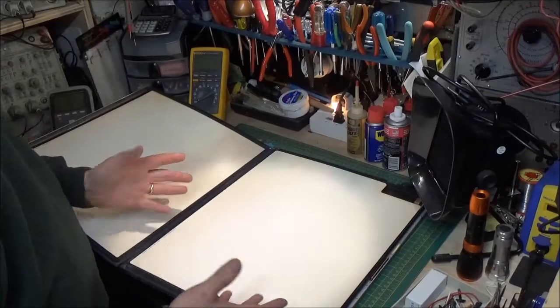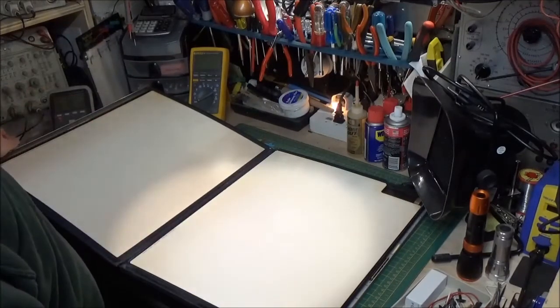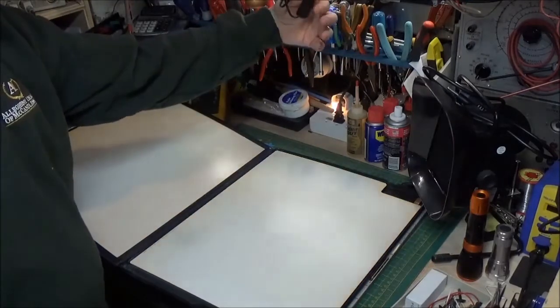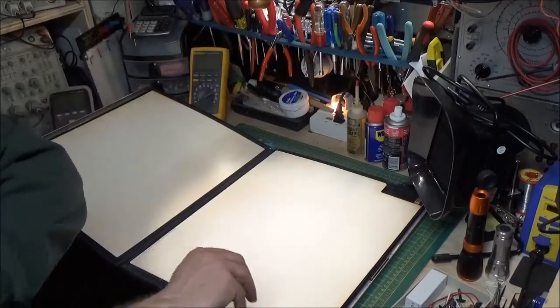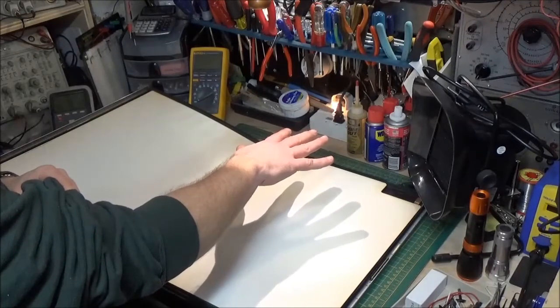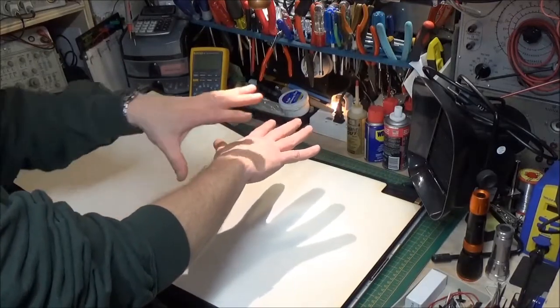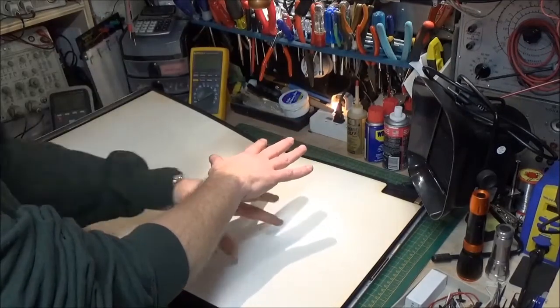That green light reacts with the emulsion on the x-ray film, causing the image. If you look here, I have an actual visible light. If I take my hand and place it under that light, it makes a shadow. Wherever the light is being blocked or absorbed by my hand, no light gets through. Wherever there is no hand, light gets through and shines onto the surface.